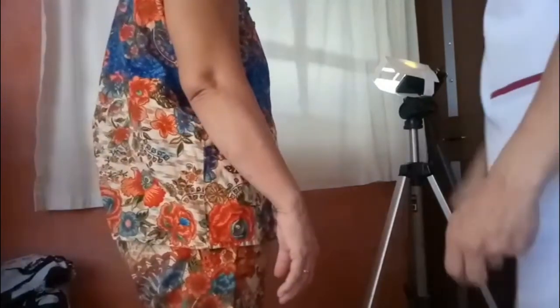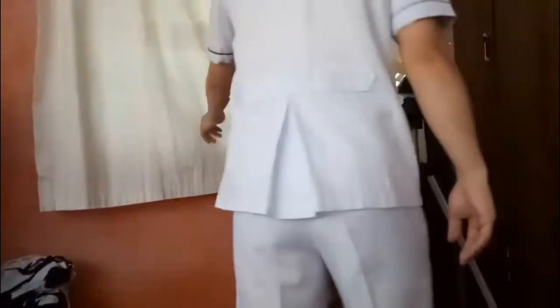Upon confirmation, tell the patient what she needs to do for you to get the desired image and make sure the patient is comfortable. Since the patient cannot assume a recumbent position, we're going to do the AP upright. Shield the gonads and tell the patient to suspend respiration upon shooting of the X-ray.